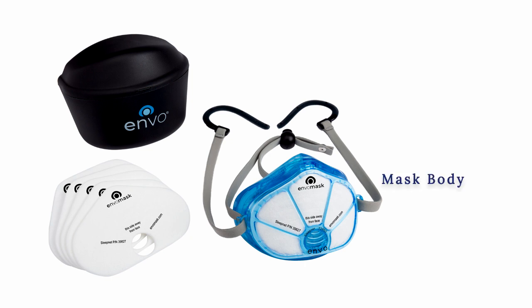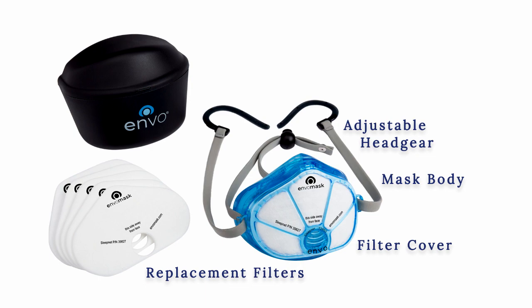Your EnvoMask comes with a mask body, filter cover, adjustable headgear, replacement filters, and storage case.